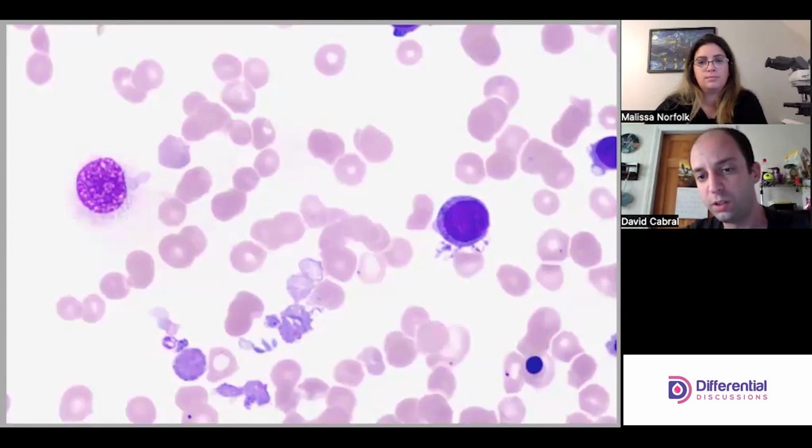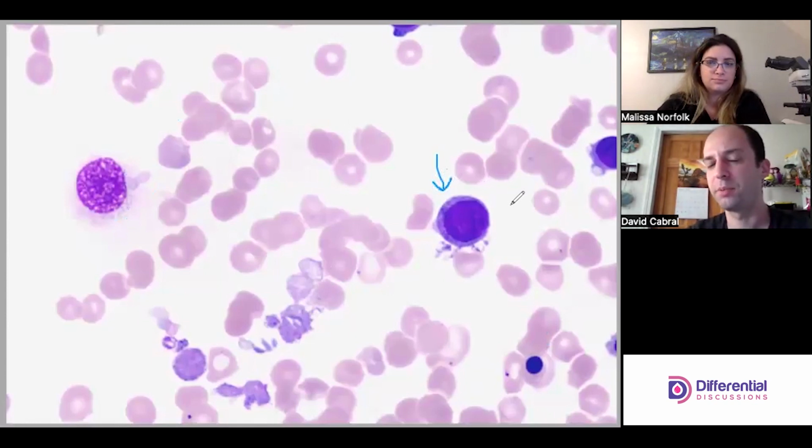All right. Okay, so I think we hit the other things in the field, and now we've got to go to the elephant in the field. Yeah, this fella here. Some of these cells, we're probably going to look at several fields. Some of these cells are a little bit darker, and it's harder to see the nucleus well. This one, we can see the nucleus pretty well.